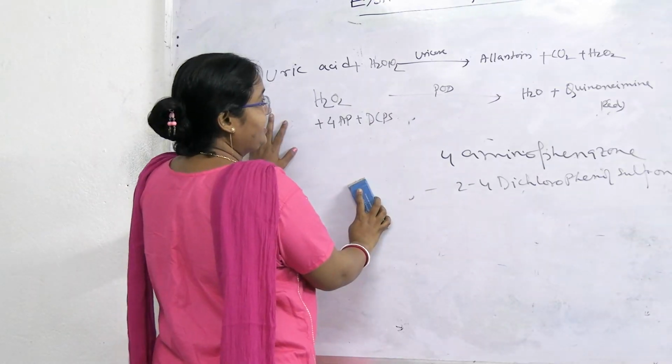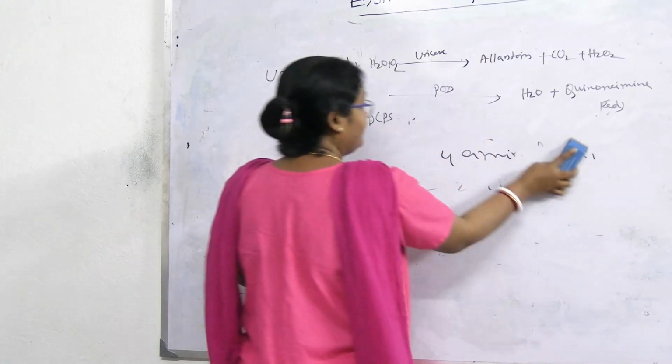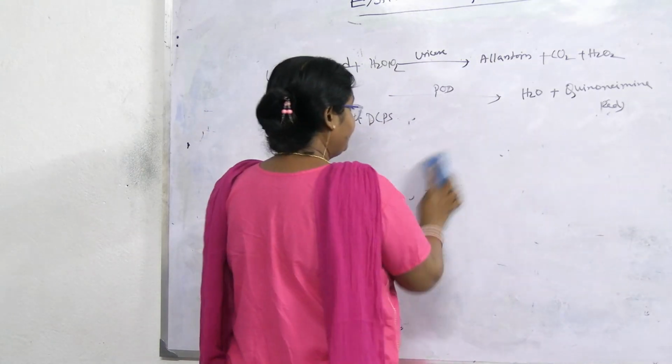So this is the reaction and method. Method is the uricase and POD method, the peroxidase method.